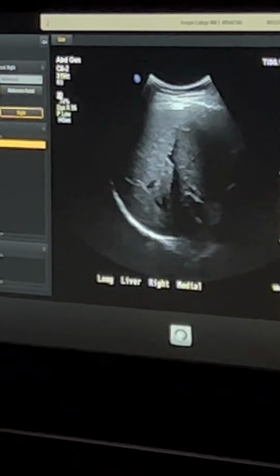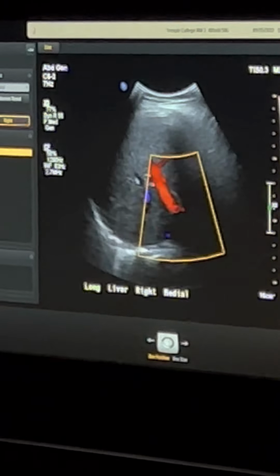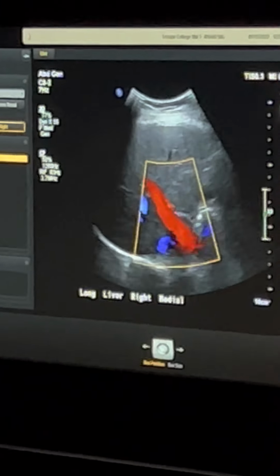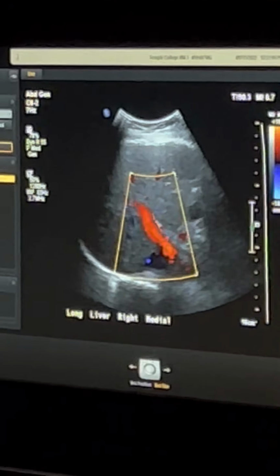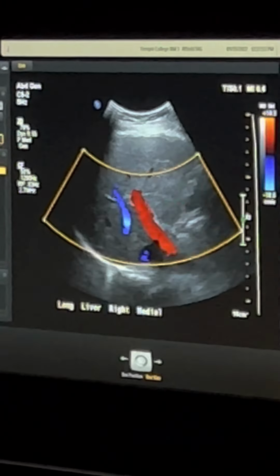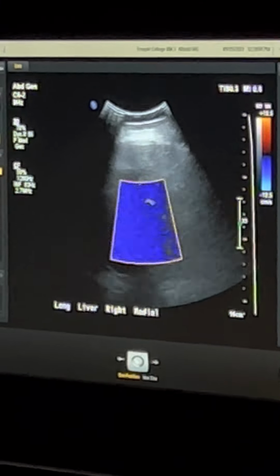Woo, your main portal. Goodness gracious. Yeah, don't let Lisa catch you scanning the liver without harmonics on. So the same thing's gonna apply too with the color. Fill your box, fill the vessel. You need to make your box smaller, but don't do this. That's fine. Okay. All right, so now let's do trans.